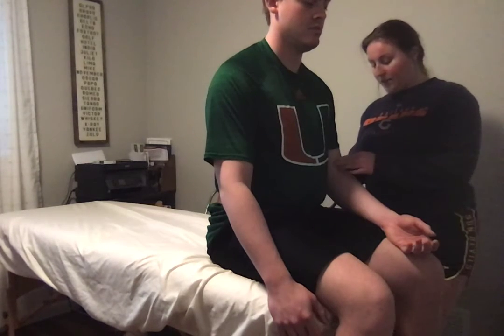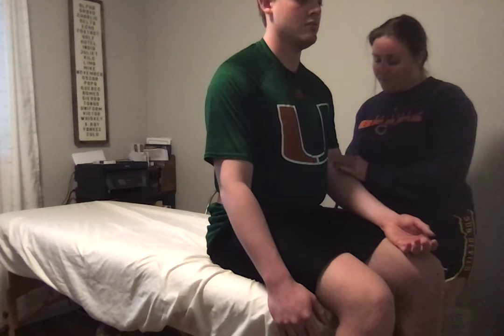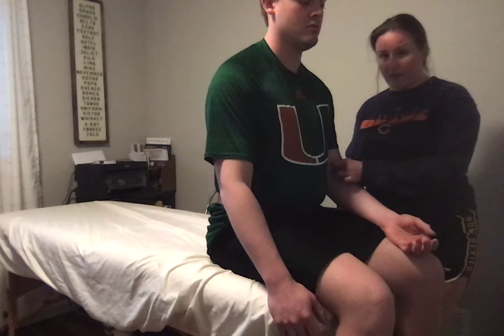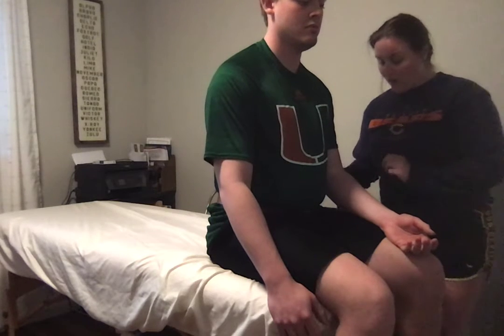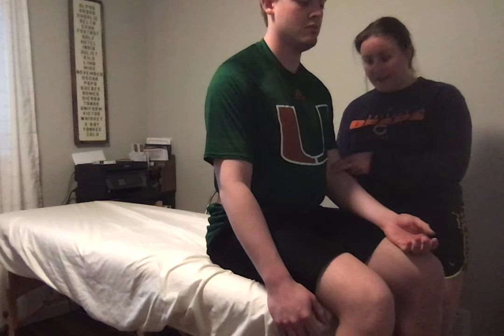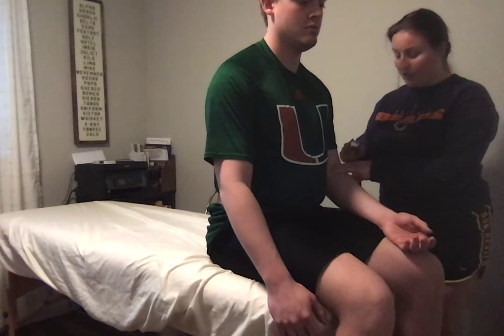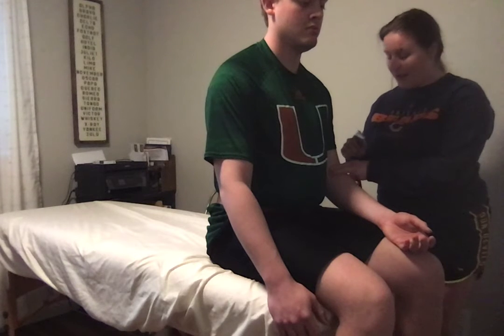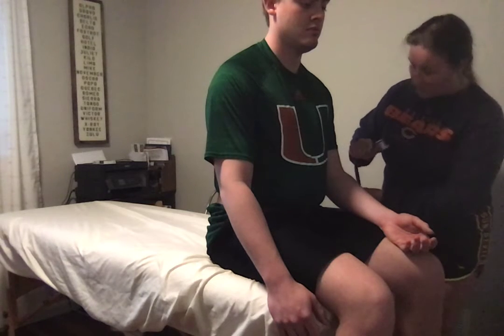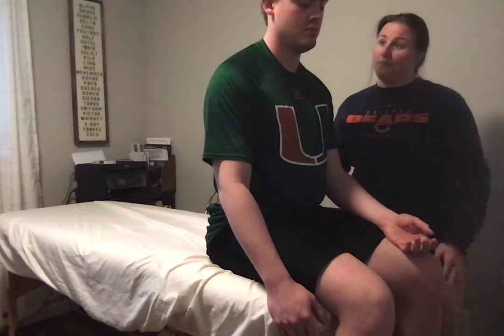With the elbow supported to test for the biceps, we're going to palpate the muscle belly of the biceps brachii. In the antecubital fossa, you're going to feel that tendon. Normally I would have two fingers over the antecubital fossa, over that tendon, and apply the reflex hammer on top of my two fingers to see the reaction. That would be a zero because there was no known reflex.